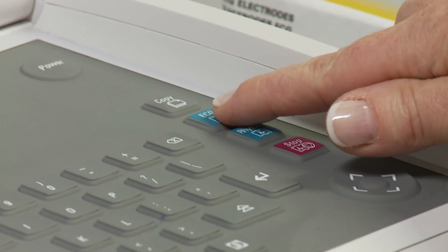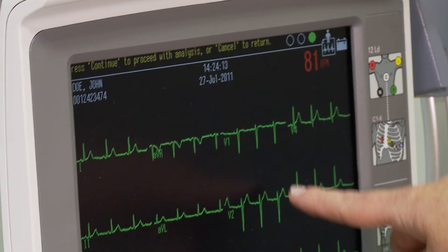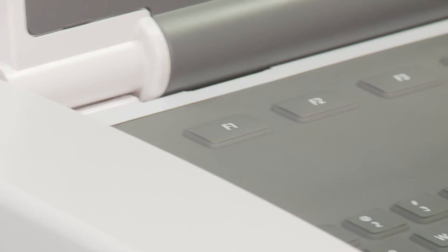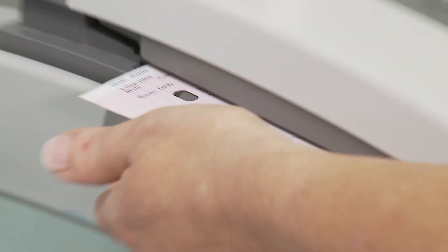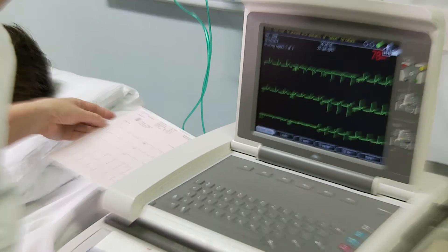Press the record button to record a 12-lead ECG. Check the recording on the screen and if this appears to be adequate, proceed to print. Once the ECG is printed out, check again to ensure the trace is artefact-free and that no extra recordings need to be performed.